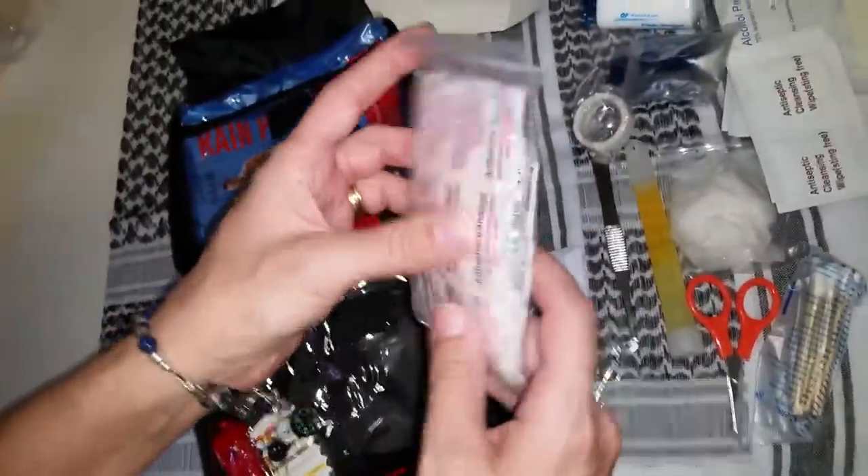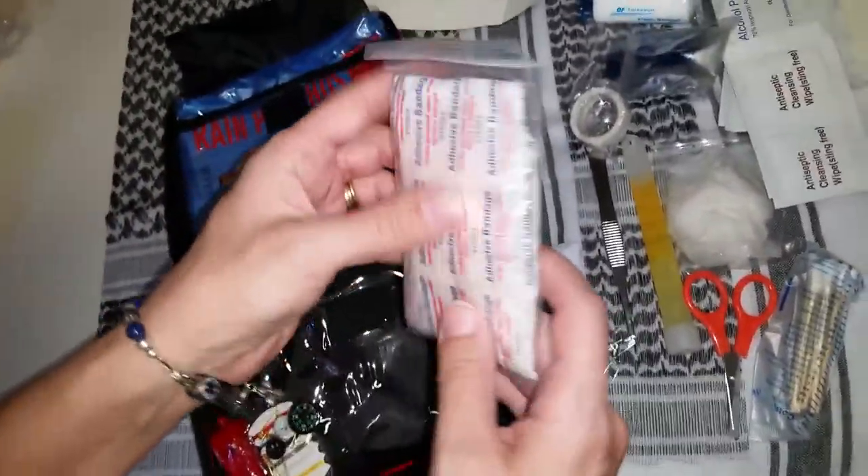Big pack of band-aids, different sizes — looks like some butterfly strips too.